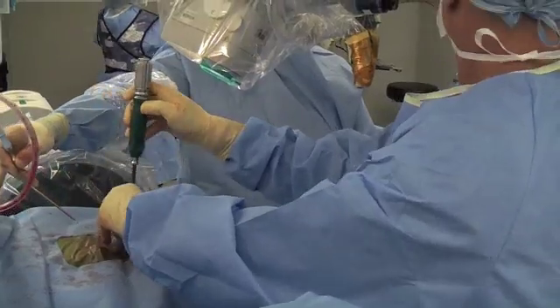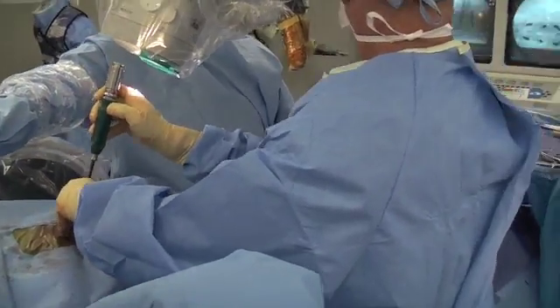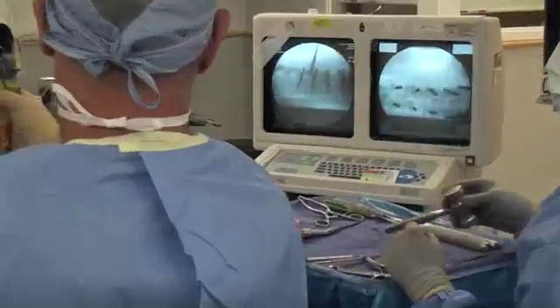I'm going to insert this, and then the fluoroscopic confirmation of my approach will shift to the lateral view. We will deliver this safe zone down past the danger zone to the disc. We are now at the safe zone again, as opposed to your vertebral line. Take the first test — fit it and feel it. Now we'll unlock the hinge, and now we'll rotate it into position.